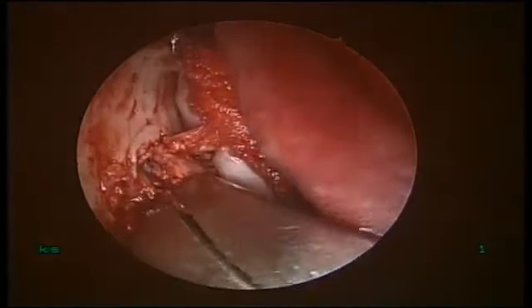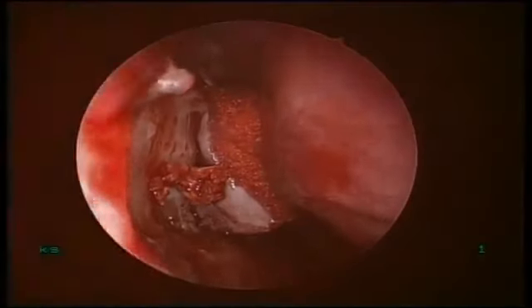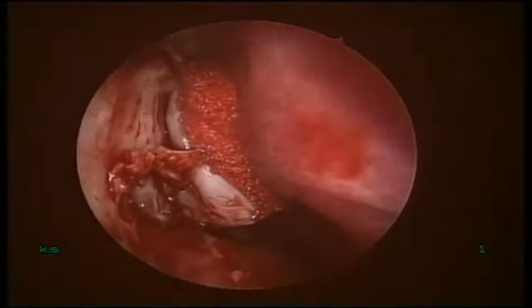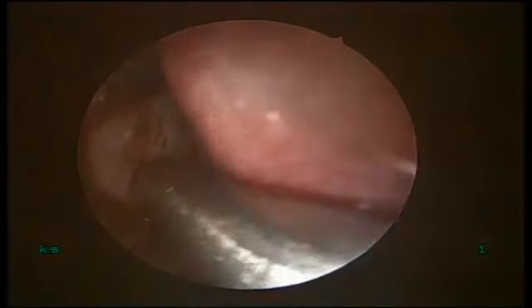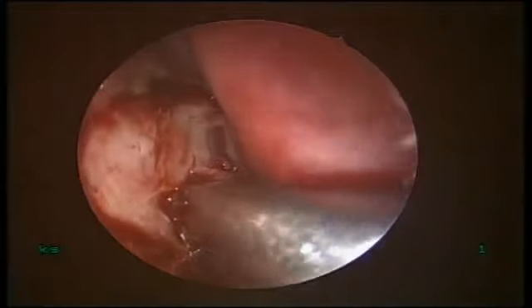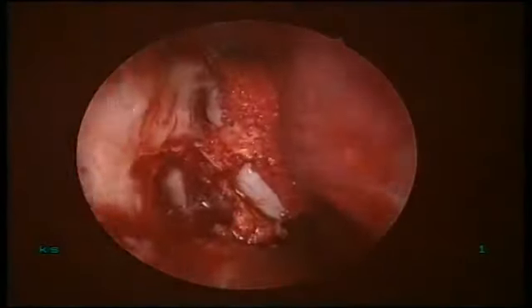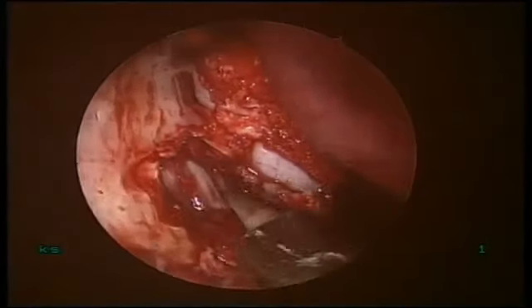Slipping, this is not mine. Give me my Kerrison. See, if I am not using my Kerrison, yes, you have to have a trick. Like engage this, hold this tightly, don't bite through, and then rotate. See, this Kerrison is slipping. My Kerrison was in there. Where? No, the straight one. I'll show you with my Karl Storz Kerrison.